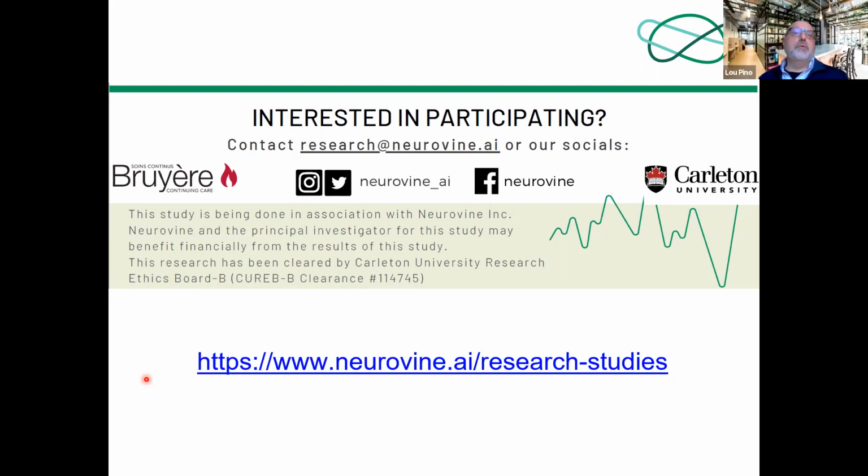Yeah, you're right. The reason I chose to provide a spectrogram in my talk was because it flowed well in terms of how I was presenting the evolution. There's no reason why you couldn't apply, and in fact it probably will work better if you apply, a convolutional neural network directly to the raw voltage values of the EEG itself.